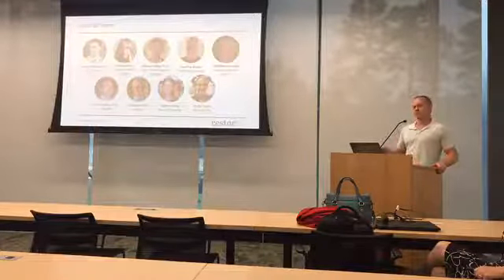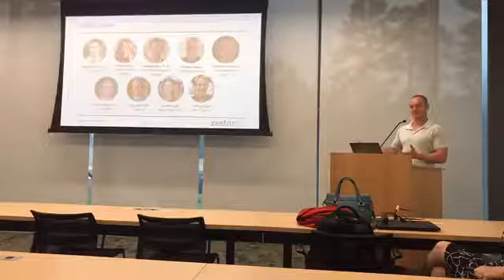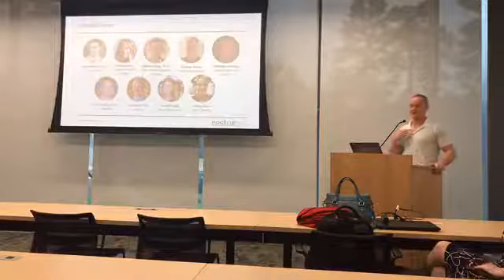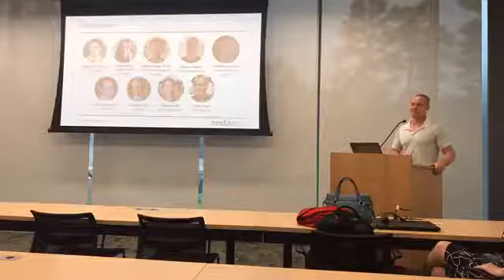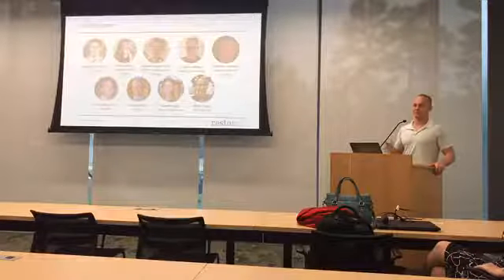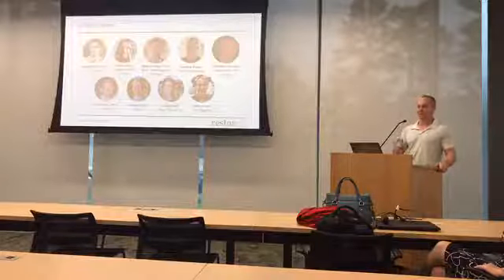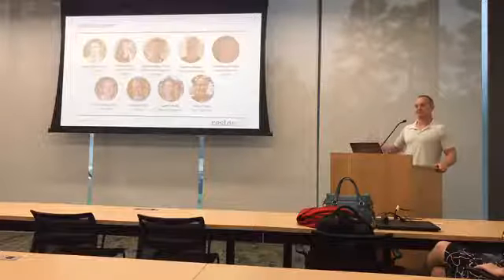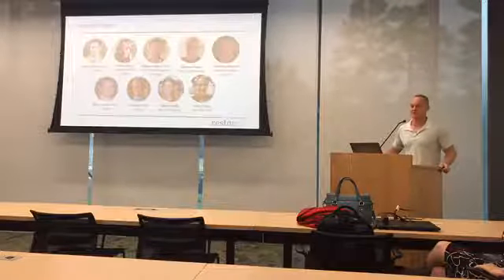Where it takes longer is if we drive some patient-specific implants, surgeon-specific implants in spinal fusion, let's say. You know, you need to build that case. It will probably take 6 months to a year to 2 years to build some of the patient data. In some cases where you have a procedure that's happening once a month and it's just really spread out, you need to get 30 patients, it could take 5 years to build outcome data.